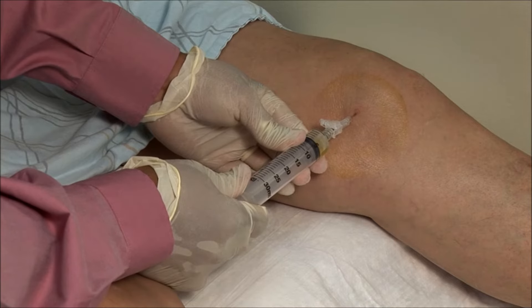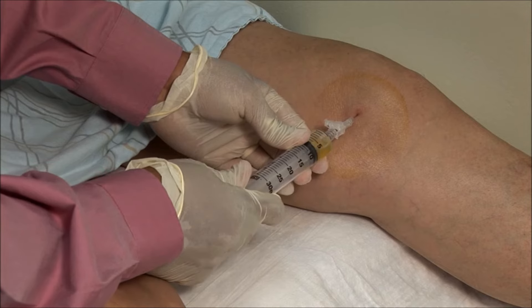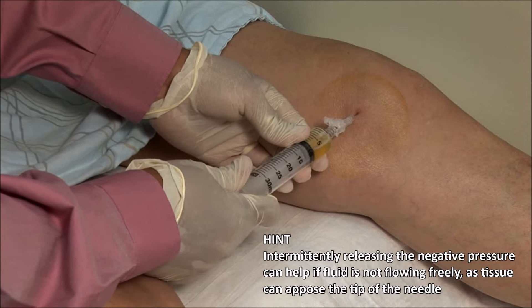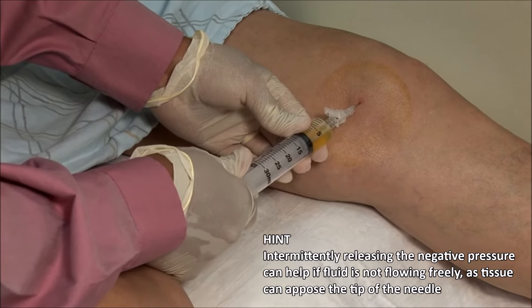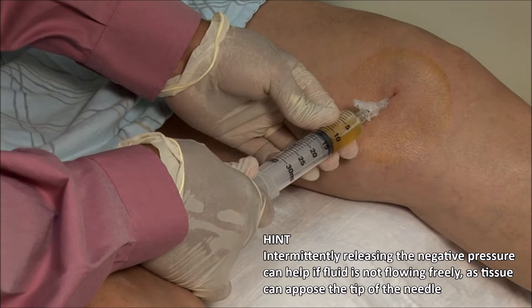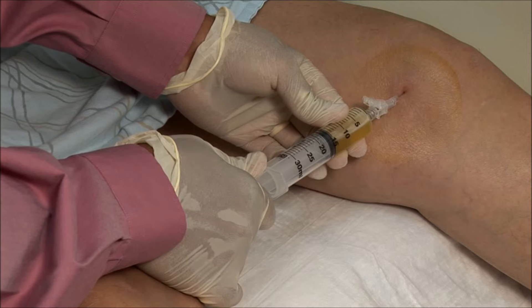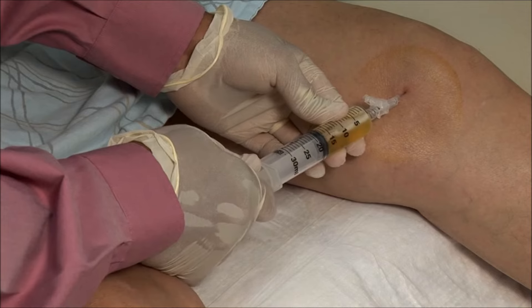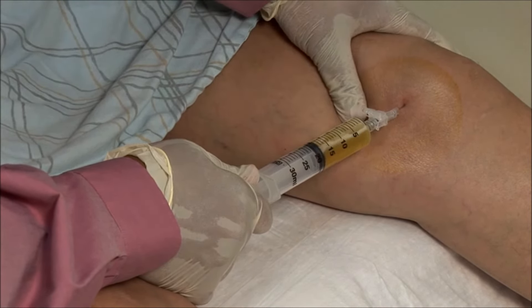Aspirate as much fluid as possible. It is useful to gradually release and apply pressure. Applying too much negative pressure can cause tissue to adhere to the tip of the needle and stop the flow of fluid. You can also apply some pressure on the knee to help the fluid escape.